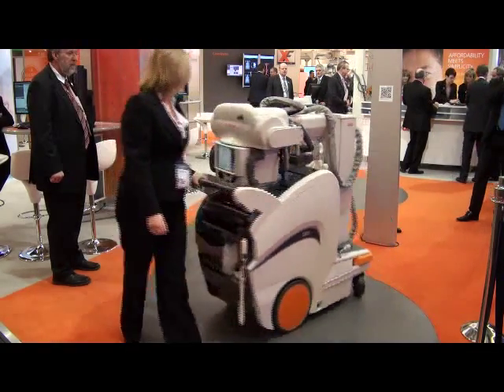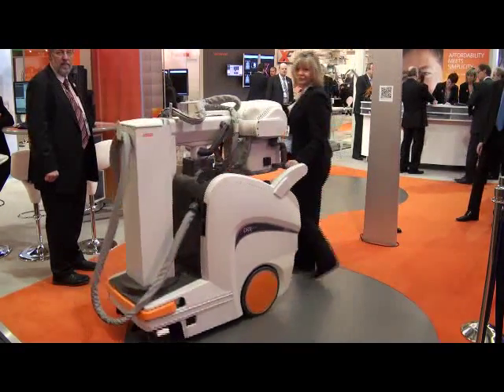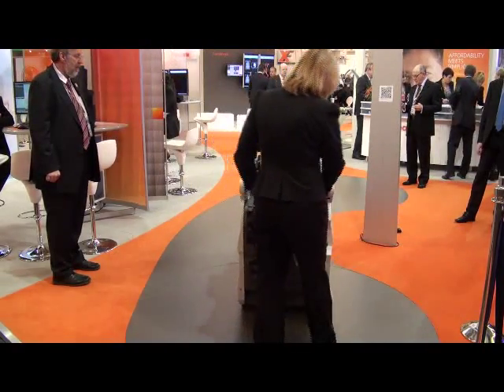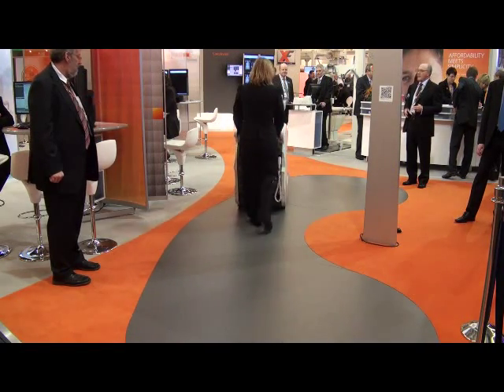The mobile x-ray machine is a brand new machine to CareStream. It's been designed with radiographers in mind. It's got a unique collapsible column so that when radiographers are driving the machine around the hospital they've got a clear view in front of them rather than having to move around.